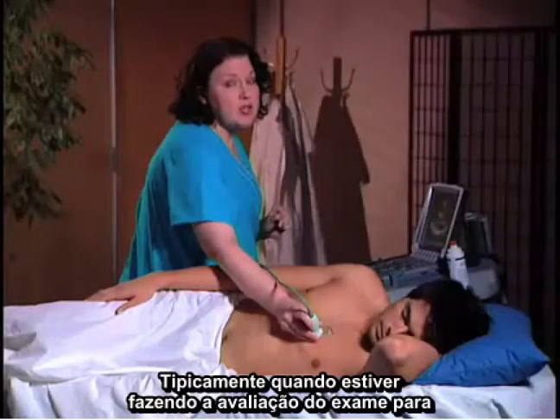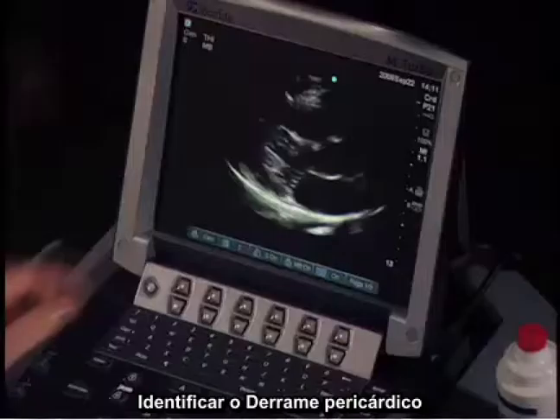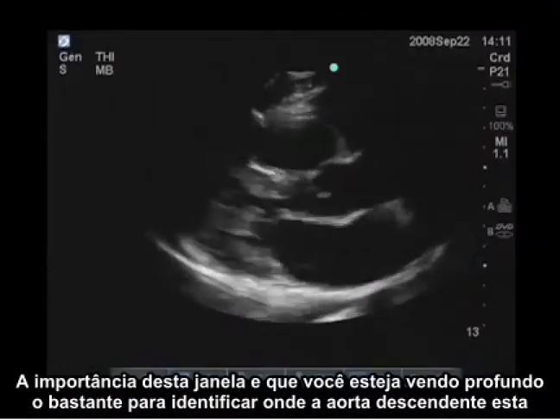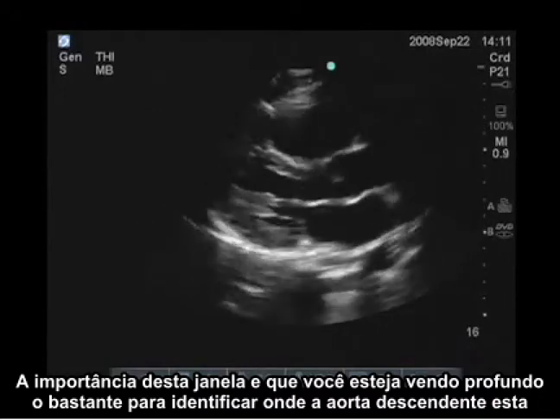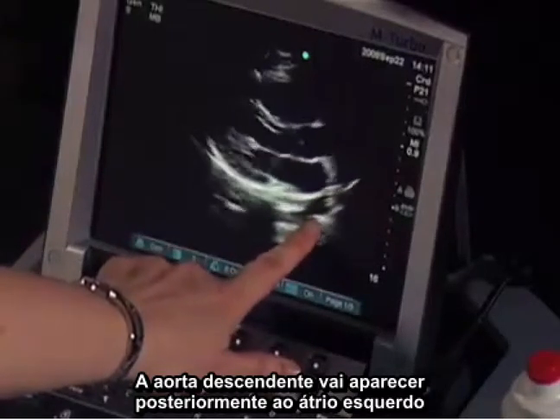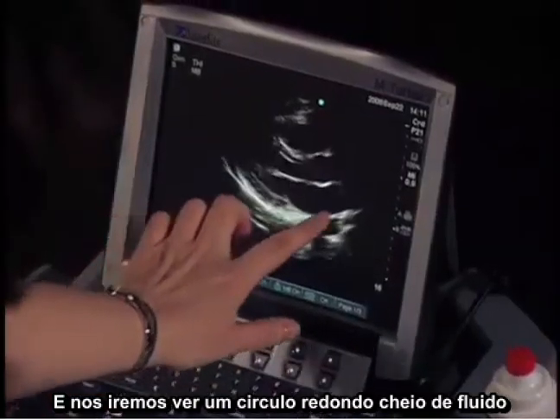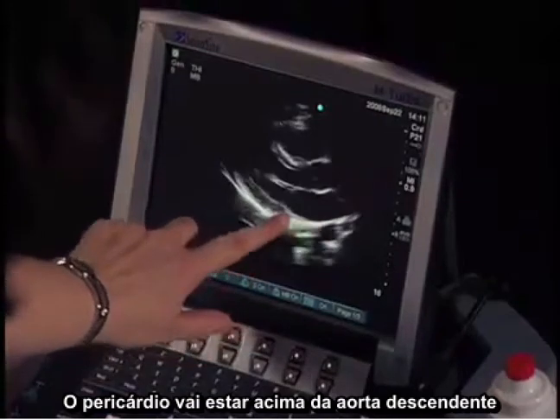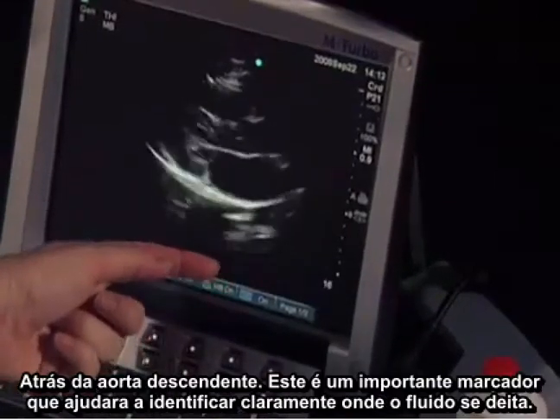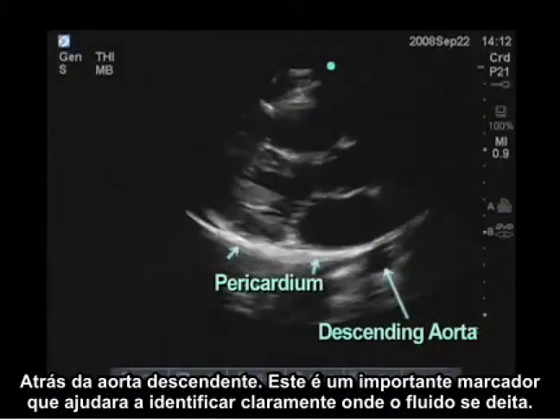Typically we're doing this examination to evaluate for pericardial effusion, so we want to identify the pericardium — this is going to be the bright white line around the heart. It's important in this view that you have it deep enough so that you can identify where the descending aorta is. The descending aorta will appear posterior to the left atrium and we're going to see it as a round circle. If fluid is in the pericardium, it's going to be above this descending aorta. If it's a pleural effusion, it's going to be behind the descending aorta. This is a very important landmark to identify so you can clearly establish where the fluid is present.